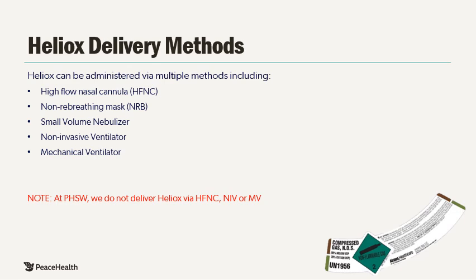Heliox can be administered via multiple different methods, including high-flow nasal cannula, non-rebreathing mask, small volume nebulizer, non-invasive ventilator, and finally a mechanical ventilator. But take note that at Peace Health Southwest, we do not deliver Heliox via high-flow nasal cannula, non-invasive ventilation, or mechanical ventilation. So our only mode of delivery is the non-rebreather mask or a small volume nebulizer.